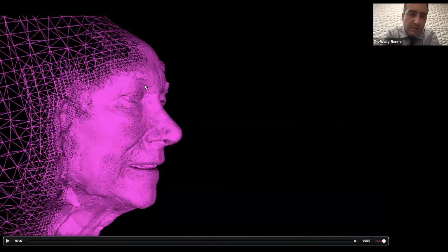Excellent. Next question here. How did you decide the size of the anterior teeth as in the case of the severe microdontia? That's a good question. There's a couple studies, interestingly enough. If you look at the average size of a central incisor, which determines the size of everything else, it's somewhere between 10 and 11, okay? And there's other studies that look at the iris diameter, and the iris diameter could set the mesial distal width of the central incisor. For me, I always try to be in that 10 to 11 millimeter range.